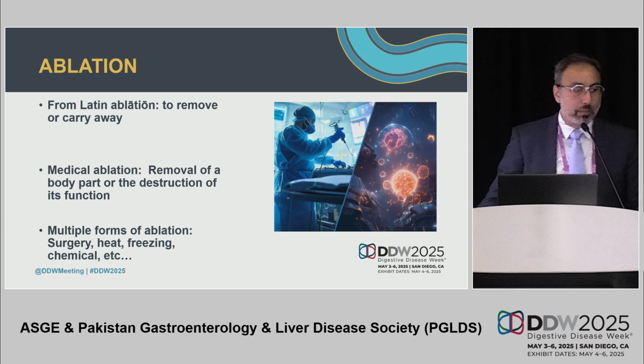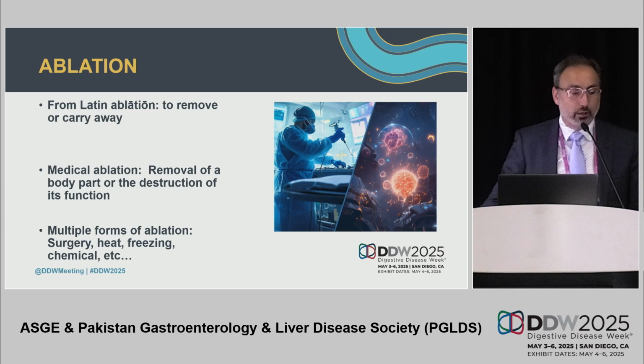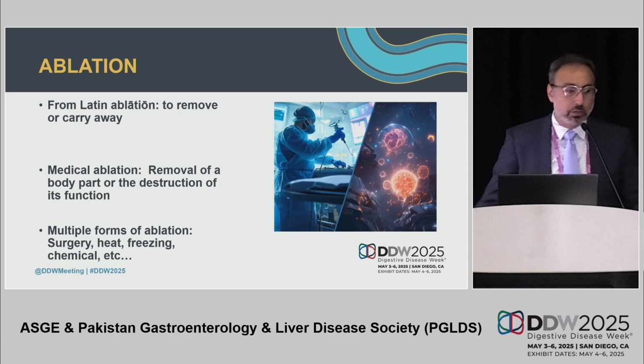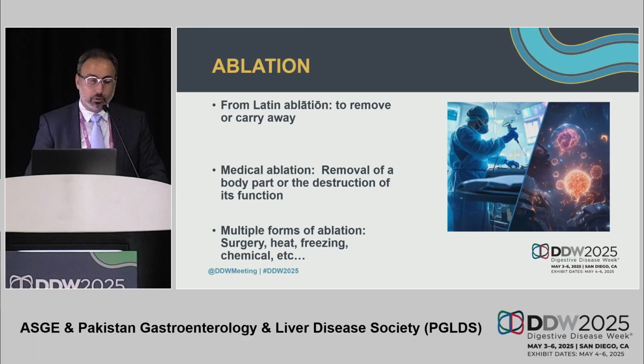Ablation is from the Latin term to remove or carry away. There are many forms of ablation. Medical ablation is the removal of a body part or the destruction of its function. In its general form, almost everything we do for cancer is ablation. Surgery and chemotherapy is chemical ablation. And endoscopically, we often use technologies related to either heat or freezing or electrical, and I'll be mentioning some of these.